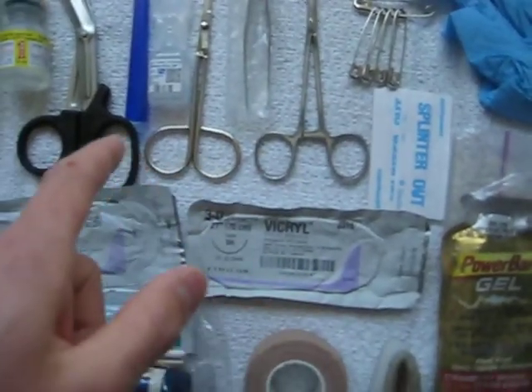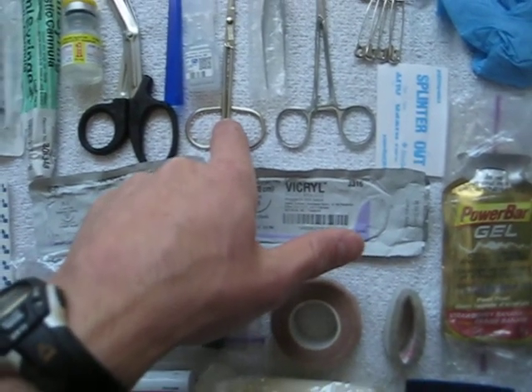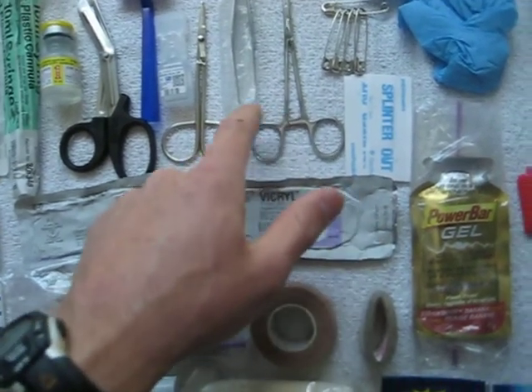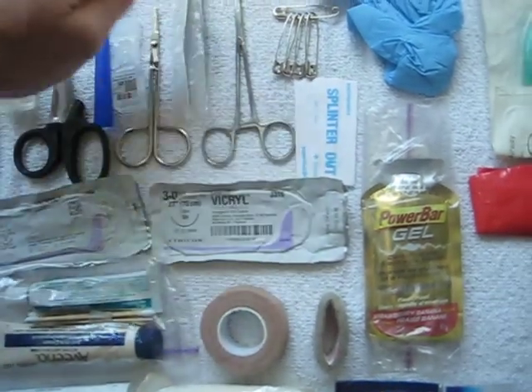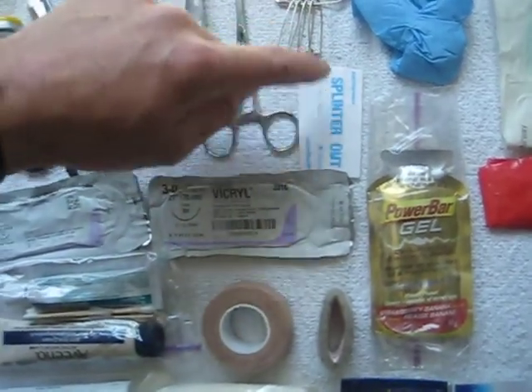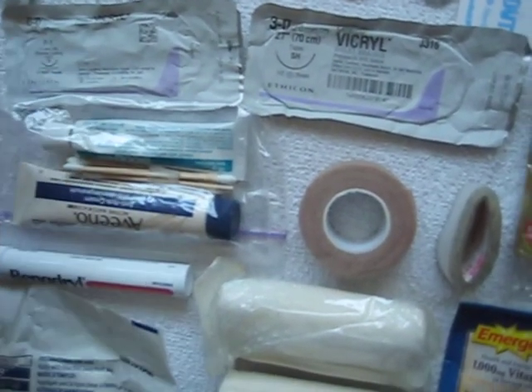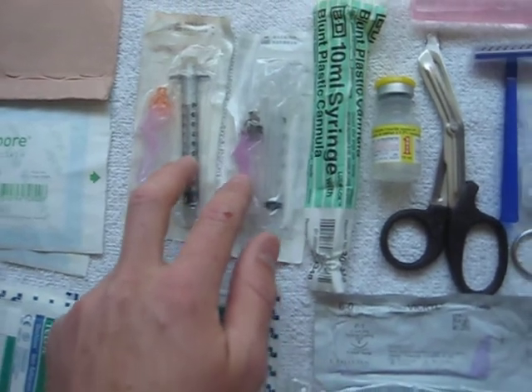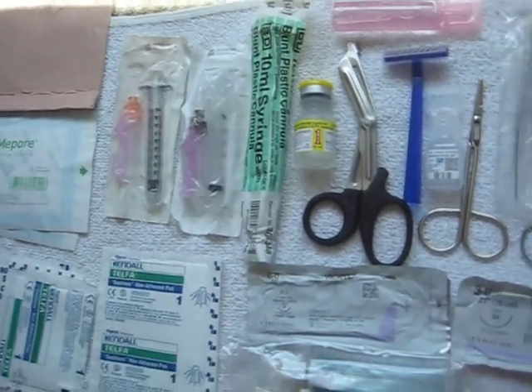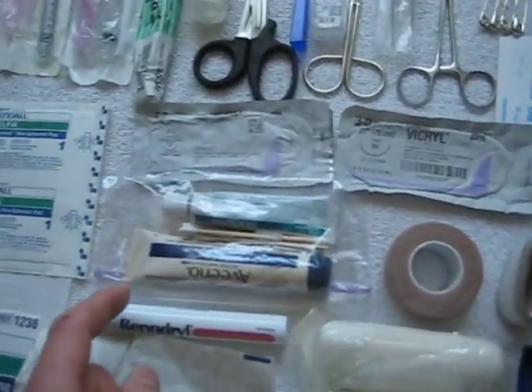Additional wound supplies would be suturing materials, a little bit of lidocaine, razor, forceps, and a hemostat, tweezers for foreign body removal from a wound, and some splinter outs. Basically a needle to help pick out splinters. Small razor blade, some Vicryl, which is the thread with the needle, sterile, and there's some syringes here, which are also multi-purpose for giving medications, as well as the Lido. Those pair of gloves, and yeah, we'll go into kind of topical ointments.